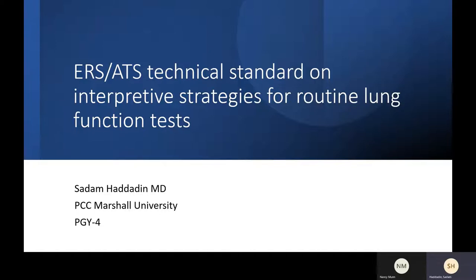Exactly. This is why they did this. They come with the Z score. The same we will do for bone density. The lower limit of normal improved as well, but they said the Z score is still more. So I think if I understood the whole idea, this is what they want to make sure they don't get into.